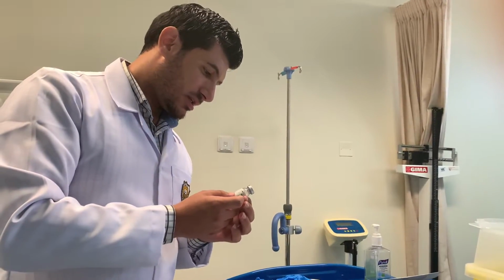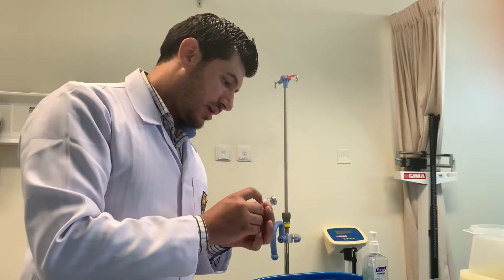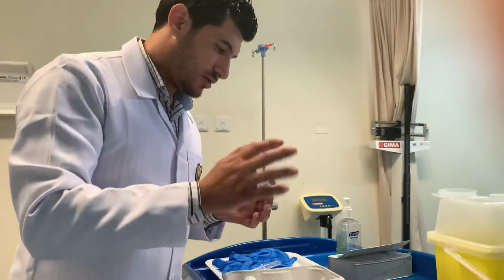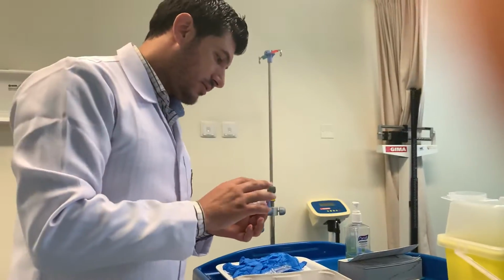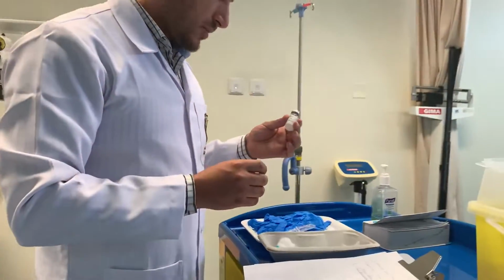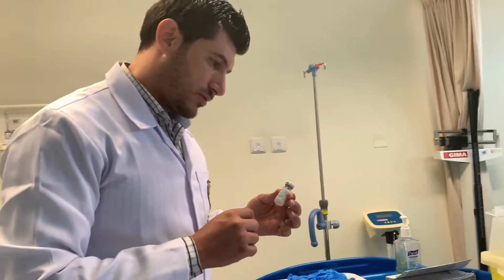So the open date is 2 days ago. So it is valid because this can be open for 29 days. According to some medications, it is only 5 or 7 days, but this can be like 30 days and then discarded. So we can take the desired dose from this ampule.